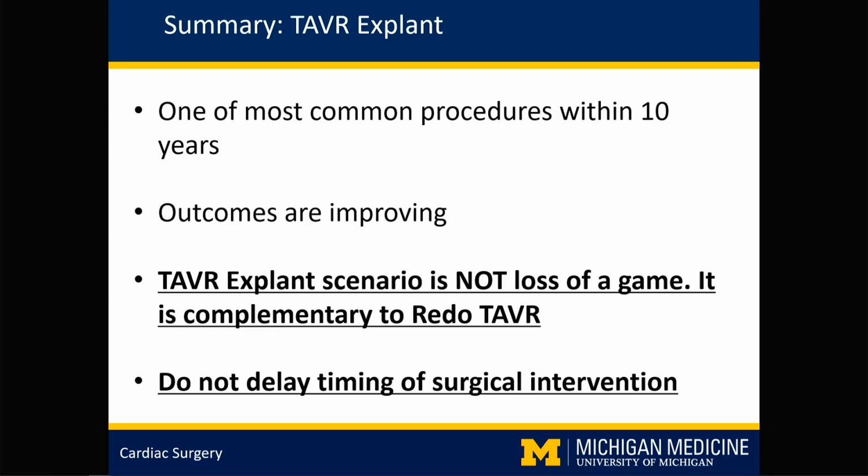We have to share our experience that TAVR explant, particularly in longer-term patients, is doing very well. This way cardiology doctors will try to refer those patients quickly rather than waiting too long. And then I think those procedures eventually should be done at probably selected centers rather than being performed everywhere.